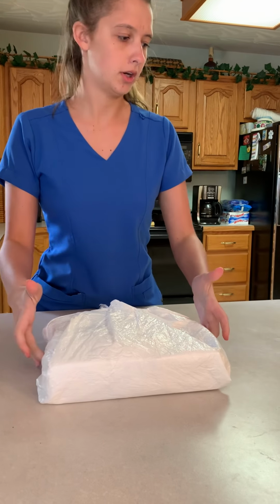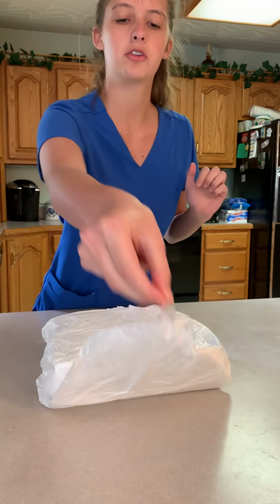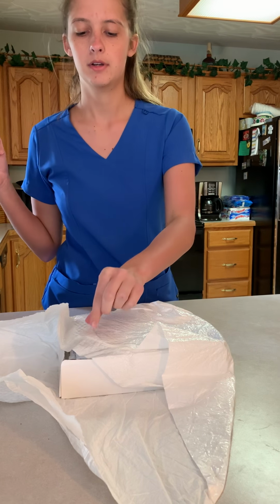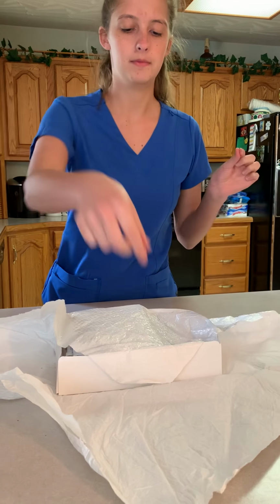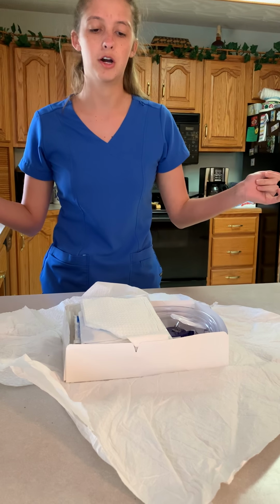Okay, so we're going to open up the tray first away, and then open to the side, and then to the side, and then we can now pull down toward us. Now that we have our sterile field open, I'm going to make sure that I keep my sterile field in my line of vision at all times, and I'm just going to step right over here so I can put on my sterile gloves. And again, I'm keeping my sterile field in my line of vision when I do this.